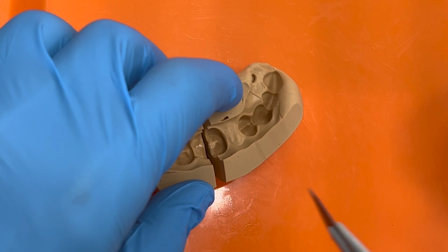Once the putty is ready, I mark 1.5 mm distally for axial reduction, keeping 0.5 mm margin of error. You can do it mesially as well if you're worried about exceeding 2 mm.